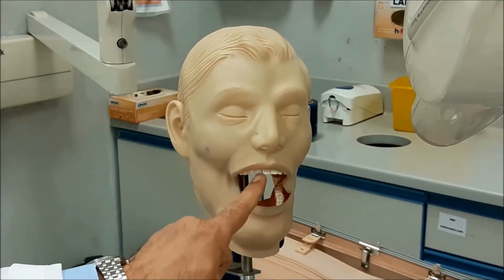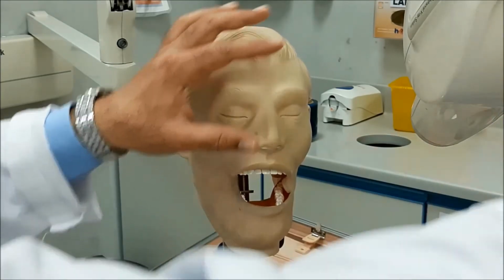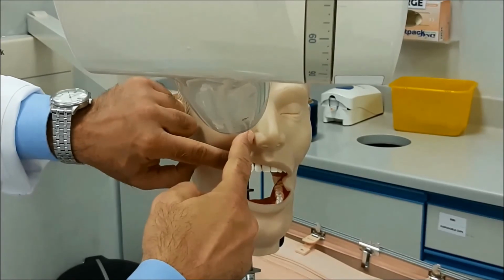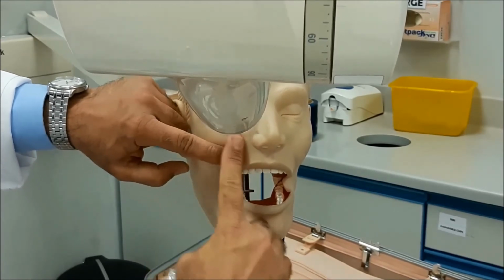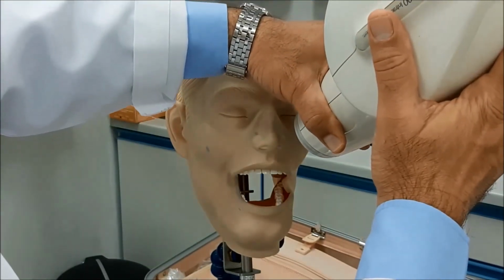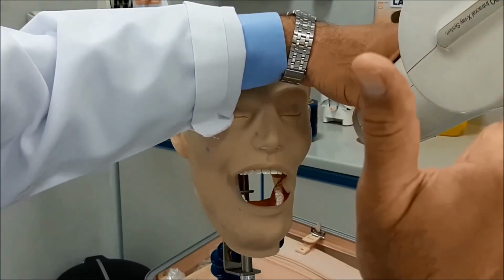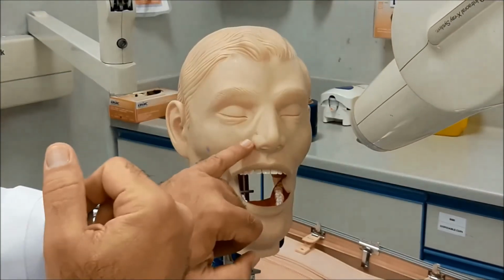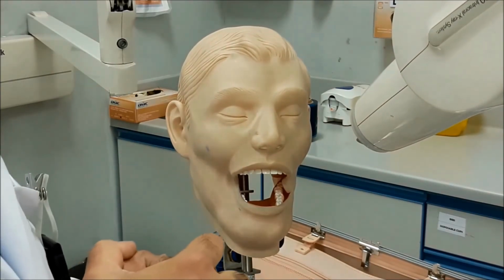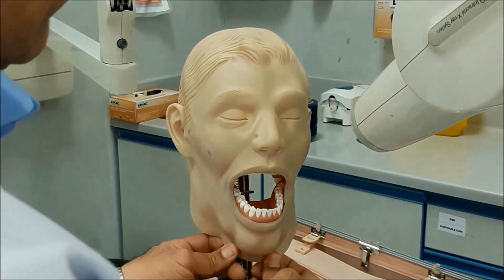central and lateral teeth. Now, if you want the canines, then your reference point will be the ala of the nose. If you extend the line from the ala of the nose, it will fall directly over the canine tooth, on either side. So, the tip of the nose is for the centrals and the laterals. The lateral border of the ala of the nose will be your reference point for the upper canines.